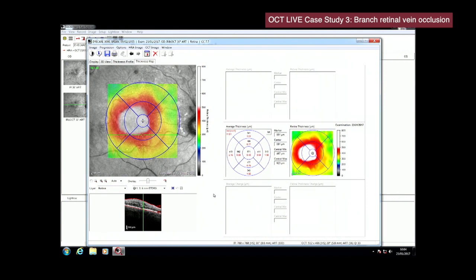Now, if you identify this kind of change, that in itself is not particularly important, but it is important to the clinician who's then treating the patient and looking for response to their therapy. So it's important to get that measurement.